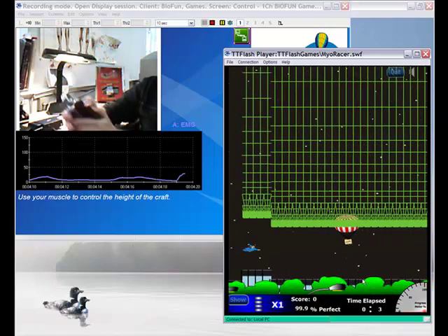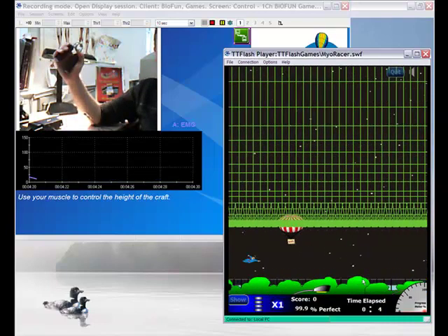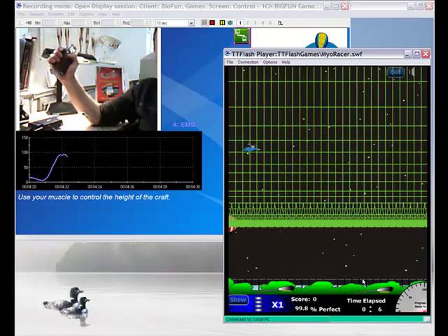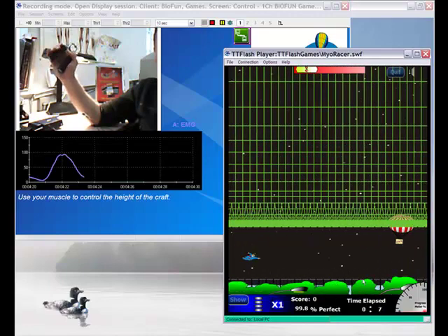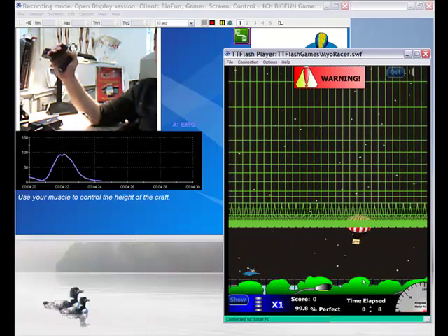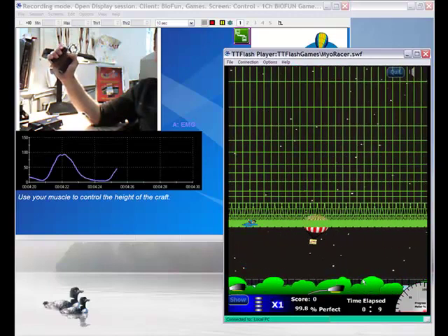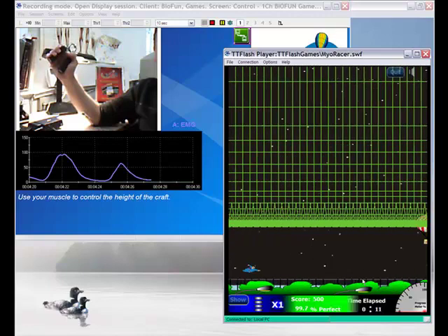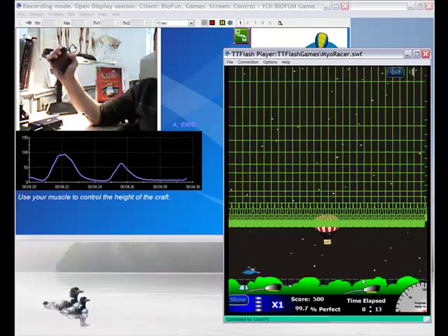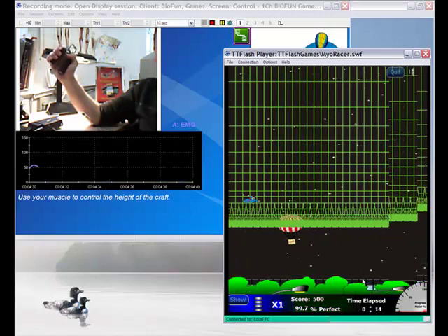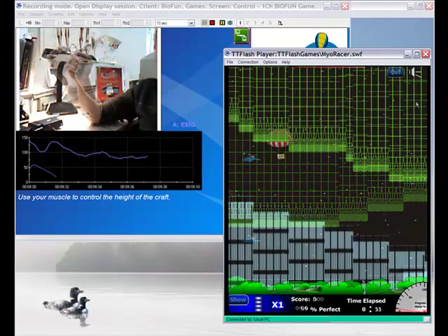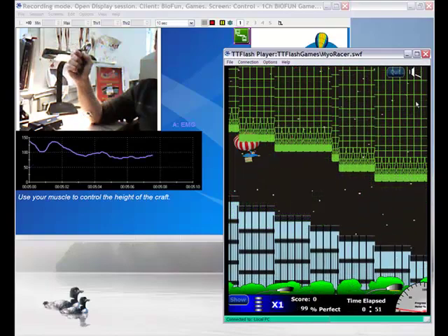As you can see, the character is controlled by my muscle tension. When my muscle tension goes up, the character goes up. When my muscle tension goes down, the character goes down.